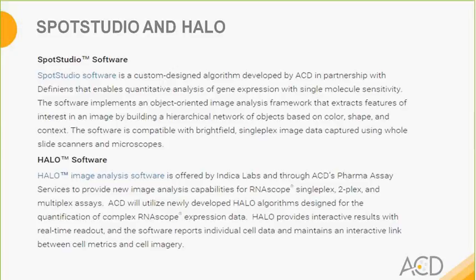HALO is a second software application offered by Indica Labs as well as through ACD's Pharma Assay Services group that provides a very similar quantitative analysis for single-plex assays, but also provides the ability to analyze more complex duplex as well as multiplex RNAscope assays.